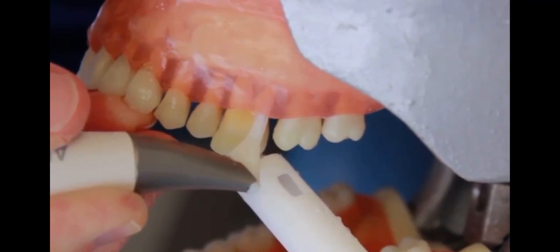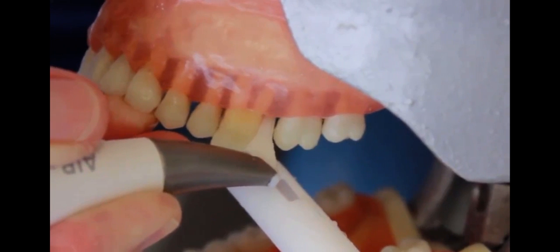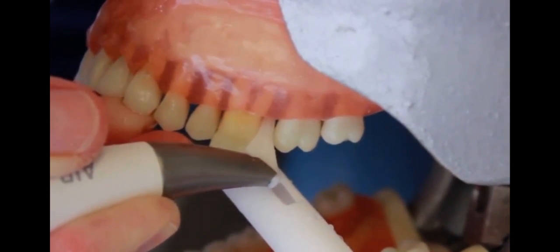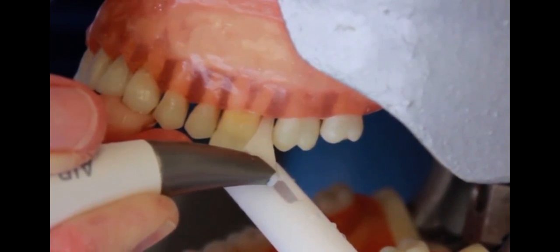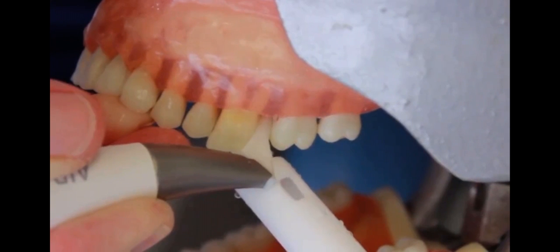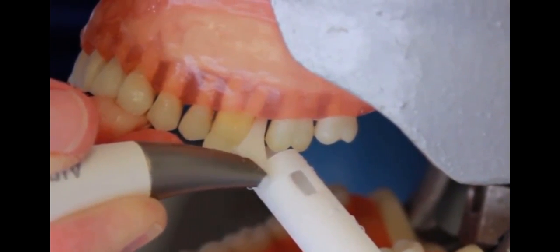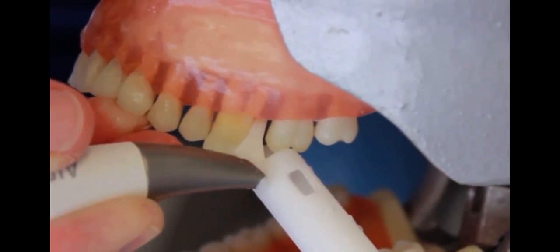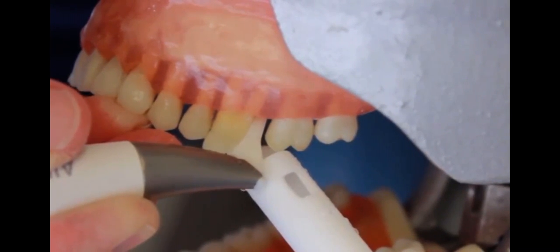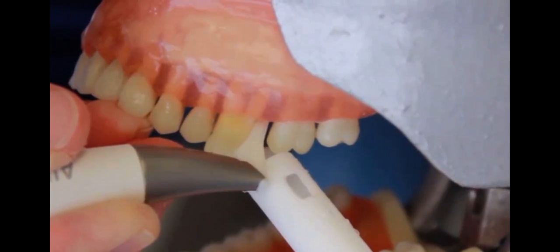We're going to find another area — there's a pocket here on the distal portion of this tooth. We're going to place the tip until we feel that junctional epithelium at the base of the pocket, withdraw one millimeter, treat for five seconds, and stop. There's a little hesitation in the water and powder flow — we want to make sure that's completely stopped before we withdraw the tip completely.